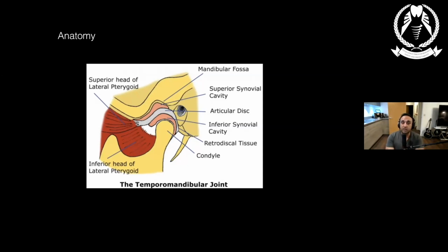So that was really exciting for me actually when they did that, because then you don't have to get your face bow out and things like that. But face bows and average value articulators are very useful tools that we use quite a lot, especially with full mouth rehabs, and the more information that you can give the laboratory, the better it is.